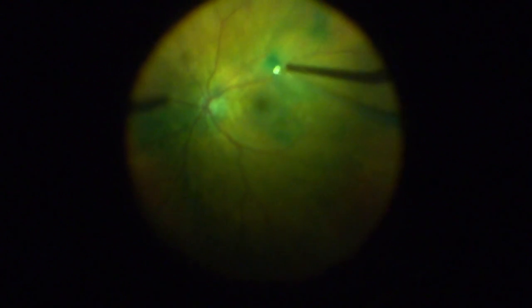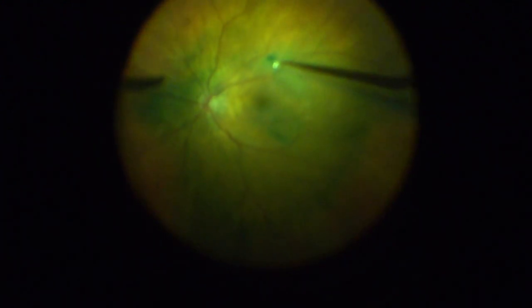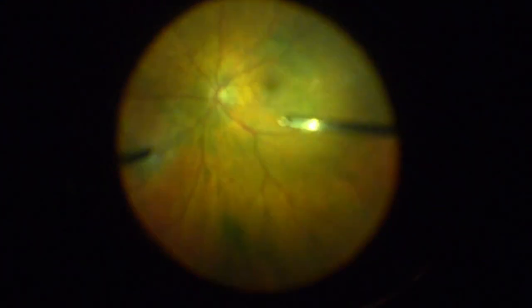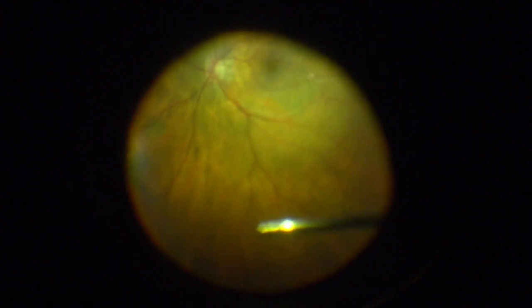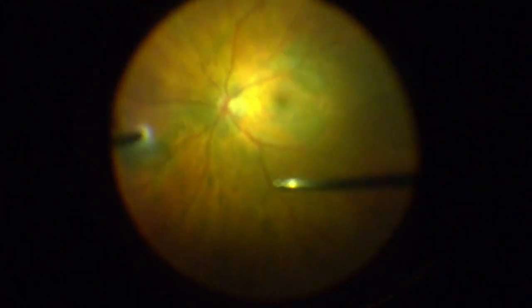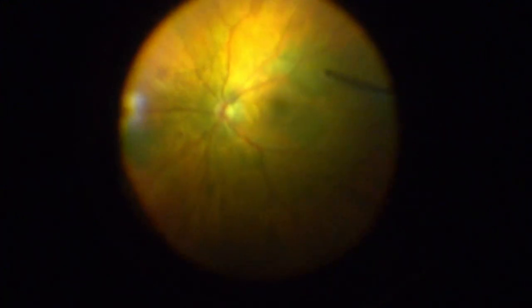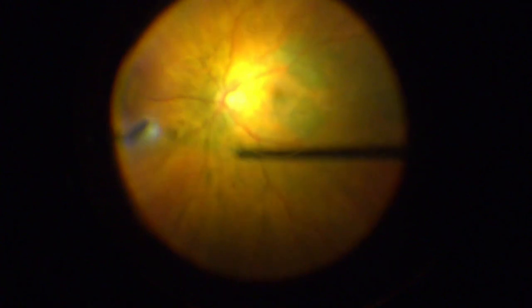Also, I don't like the idea of putting the ICG dye or anything directly on the macula under air. I just don't like that idea of something that concentrated being in touch with the most sensitive part of the retina. You can see how the dye does stain the vitreous a little bit. So if you don't use triamcinolone here and the vitreous was still down, you would oftentimes see the ICG dye staining around the optic nerve too in the vitreous. A little bit more of a squirt there, didn't quite go over. There you go.